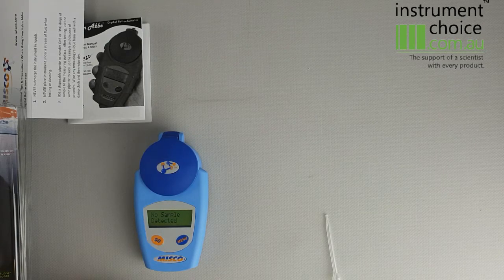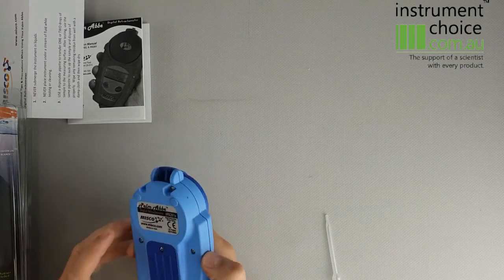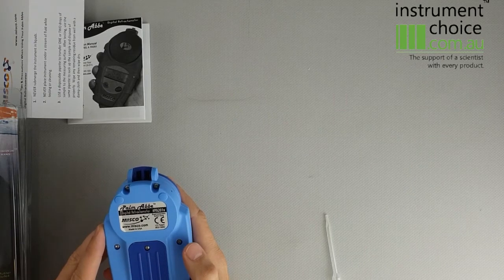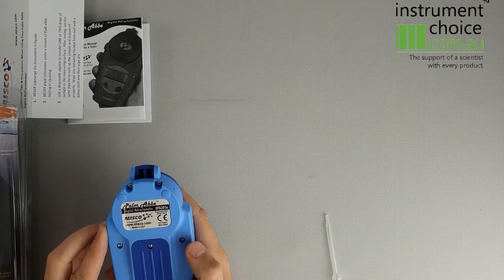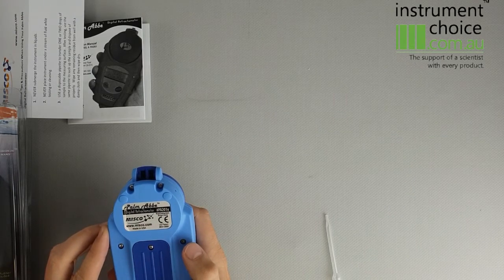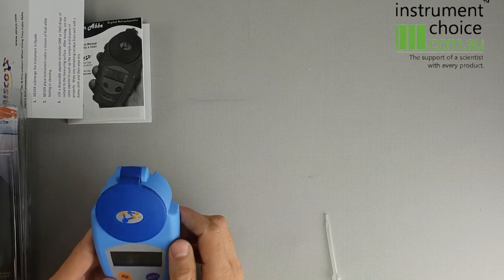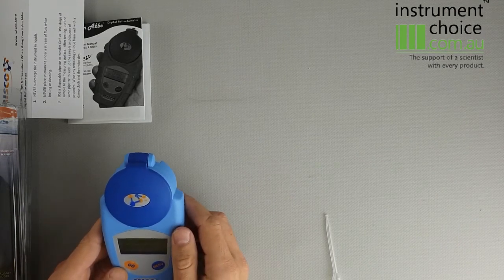So it's a fairly basic meter, very well built being a US product. It's IP65 rated so it can take splashing and some dust. It's good for field use and will last you a number of years.